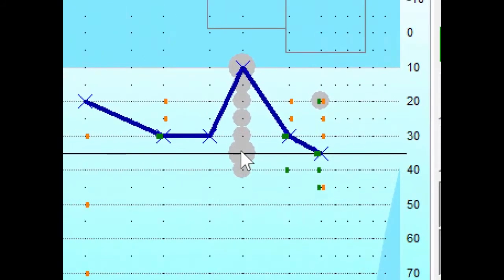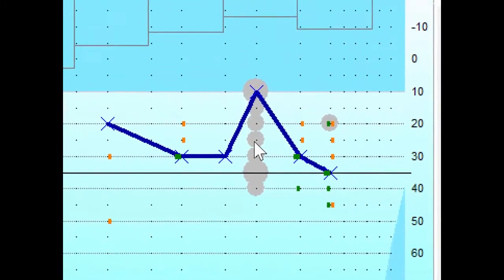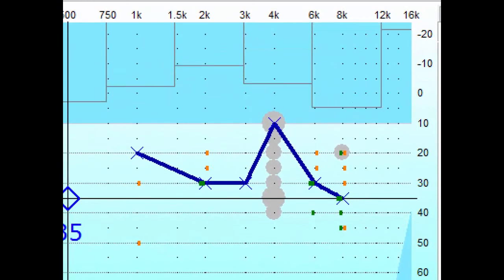If you see gray dots start appearing on the screen, it means the patient is pressing the button when no tone was presented. It means that the patient has got no clue what to do. You will have to press a pause button, explain to the patient what to do, and click the auto button again to start the automatic test.